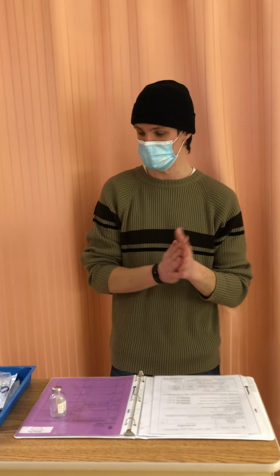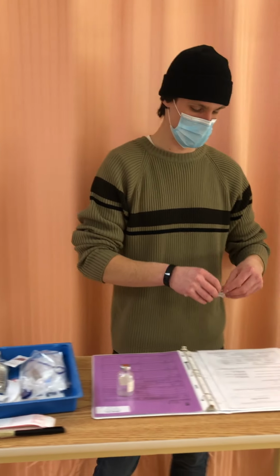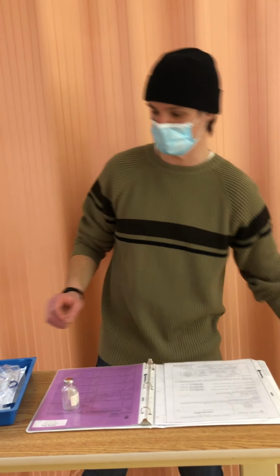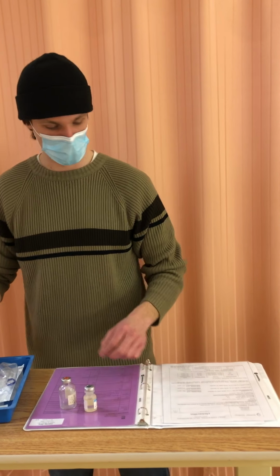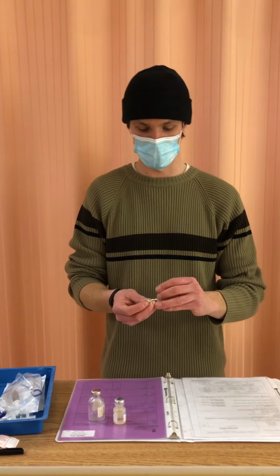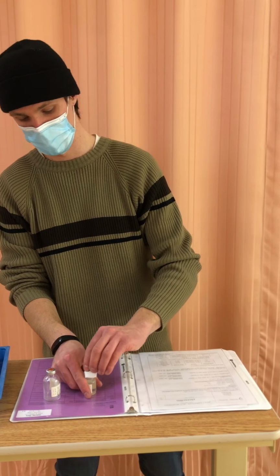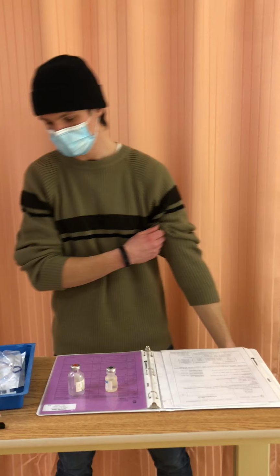So I perform hand hygiene. I would swab the top for 30 seconds, let dry for 15. I'm not going to do it for that long for the sake of the demo. And I would do the same for sterile water here. I need to reconstitute this medication with 6.8 milliliters of sterile water according to the PDM. So I'm also going to sanitize or alcohol swab the top of this for 30 and let dry for 15.